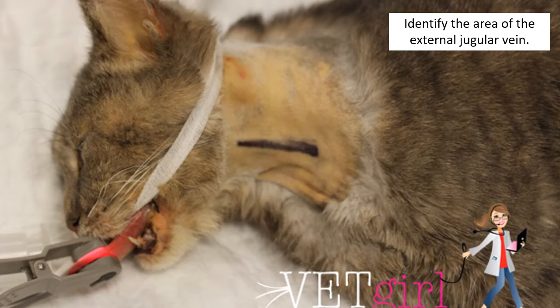The external jugular vein would automatically bulge on its own in cats upon neck extension. However, if it would not, you may put gentle pressure on the thoracic inlet, right here, around this area, I believe, to make it bulge and help you identify it.